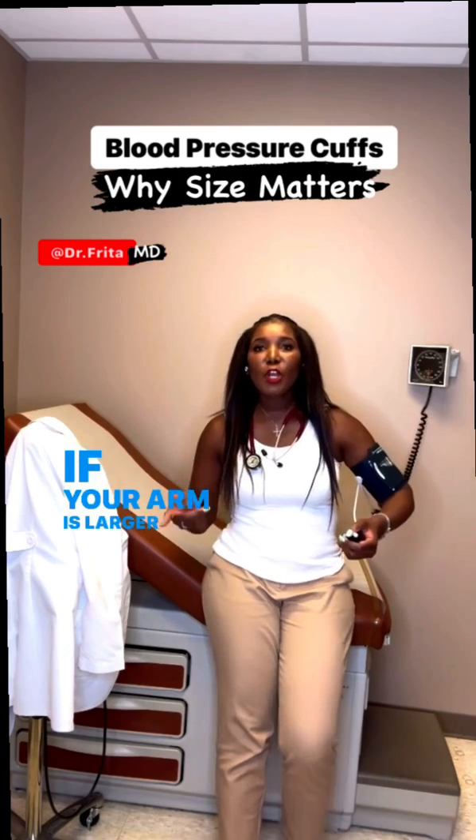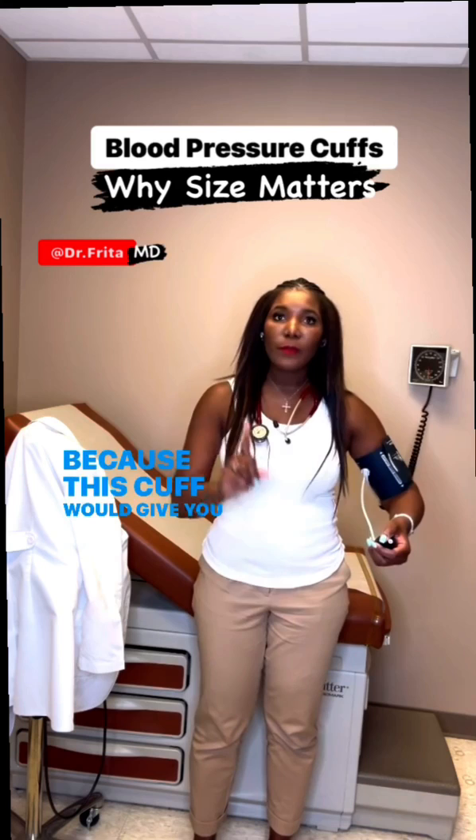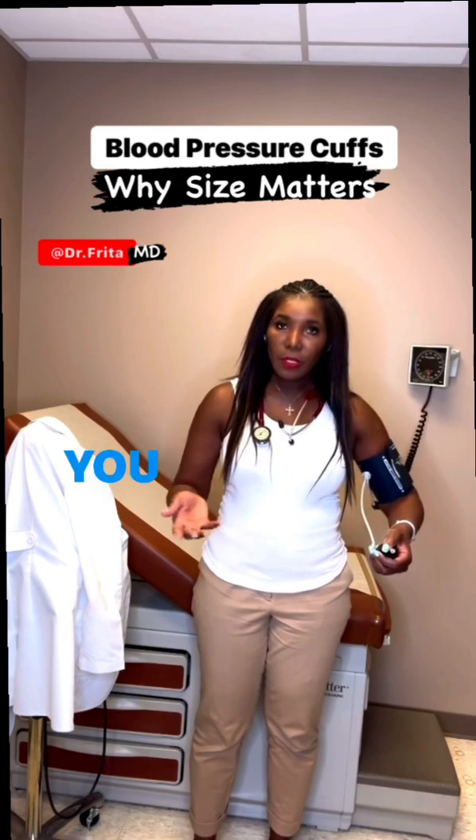If your arm is larger than 13 and a half inches, then this is not the cuff for you, because this cuff would give you a falsely elevated blood pressure — it's too tight. So what do you do? You get a larger cuff.